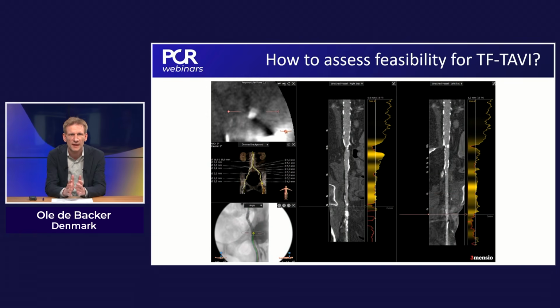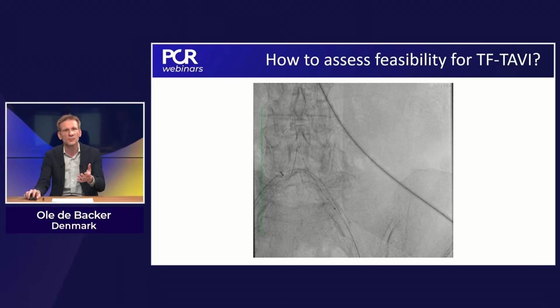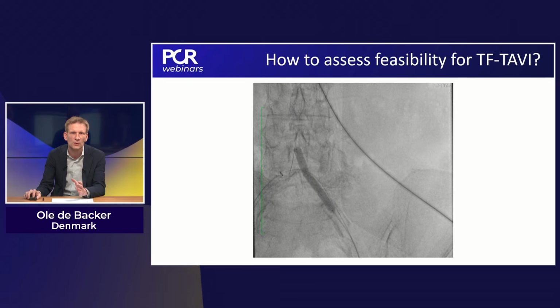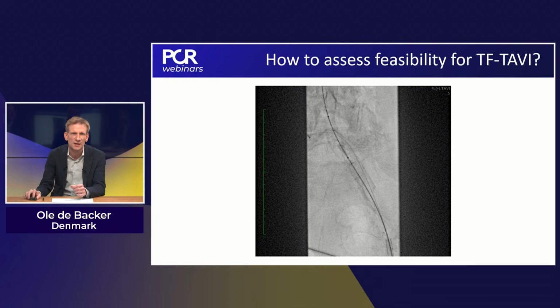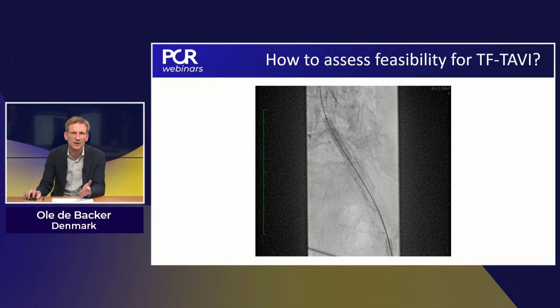This is modifiable, I would say, with intravascular lithotripsy or balloon. And you see there is, for sure, with a relatively high puncture, a calcium-free window to find for the puncture. So this is also what we did in this particular case. We proceeded with transfemoral access, but we had a safety wire built in contralaterally, and we were treating this external iliac and common iliac with IVL. So this is first an IVL balloon, followed by a non-compliant balloon, and then afterwards we delivered our prosthesis.